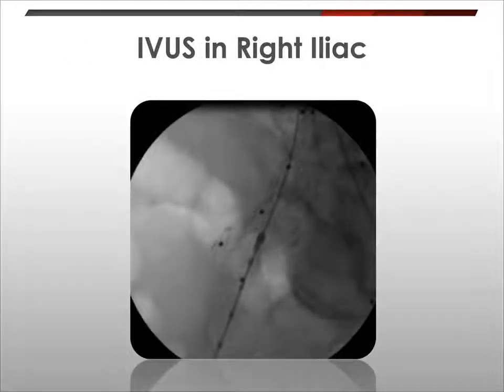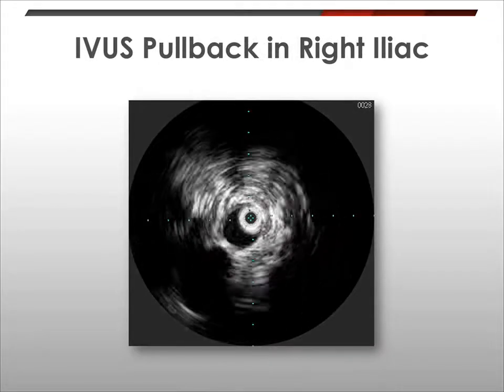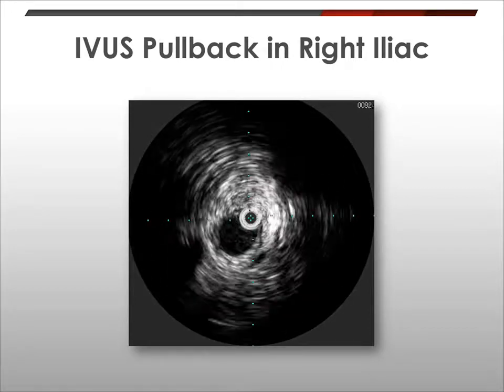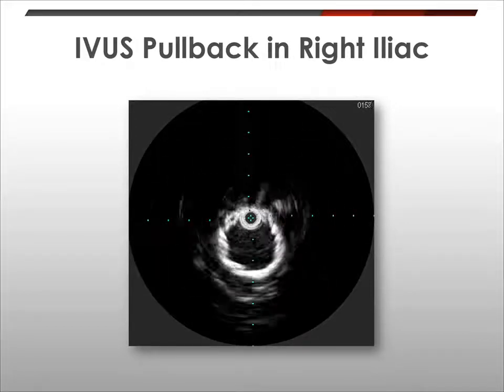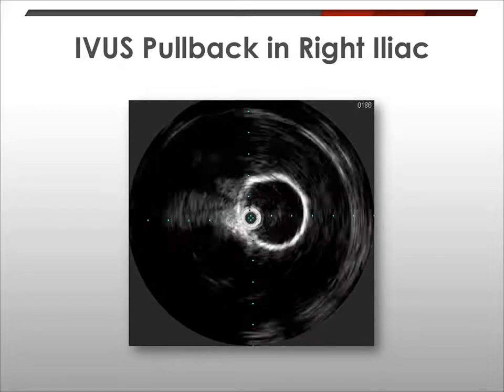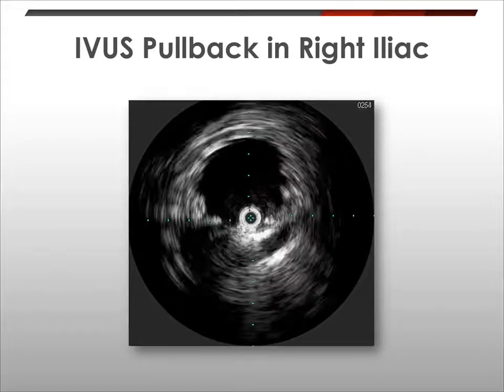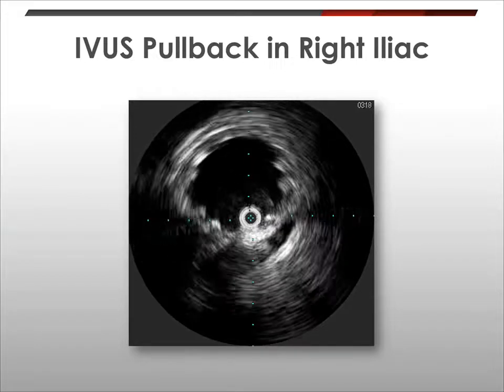The next slide shows the Endurant limb after it's been deployed with the intravascular ultrasound catheter inside of it to check for any iliac limb stenosis at that area of angulated iliac. The next slide shows the IVUS pullback on the right side, which shows the internal iliac artery takeoff and the graft deployed just above it, so that we know we nailed the area we wanted to, just above the internal, that there's no common iliac artery stent graft limb stenosis, and up in the neck that the graft has no graft infolding, and it's just below the renal arteries bilaterally.